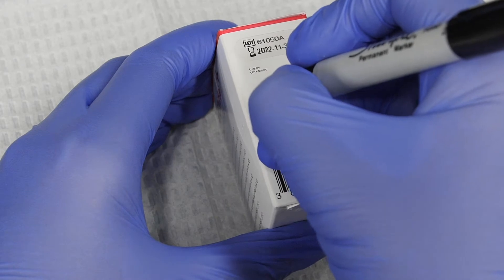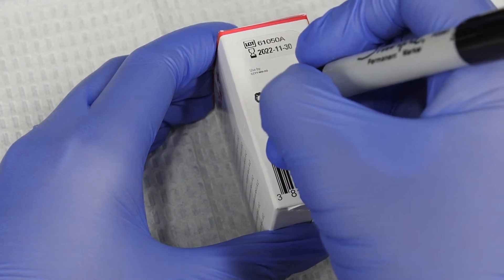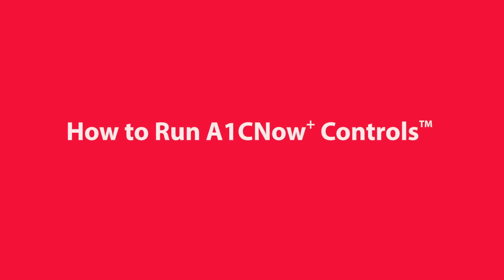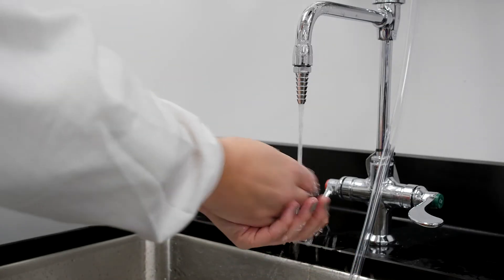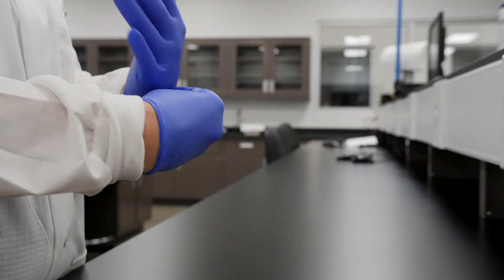How to run A1C Now Plus controls. To run controls, first wash, thoroughly rinse, and dry your hands. Then put on your gloves.